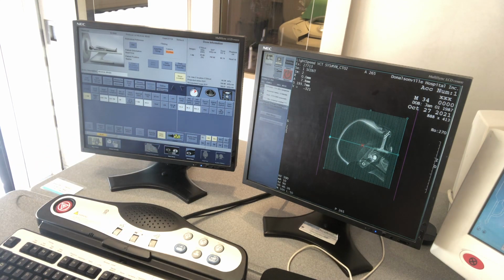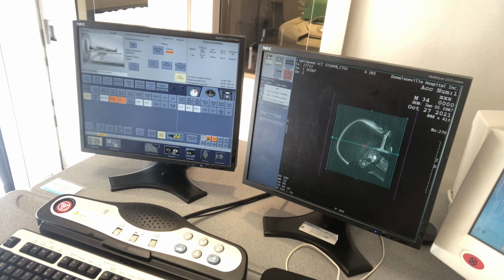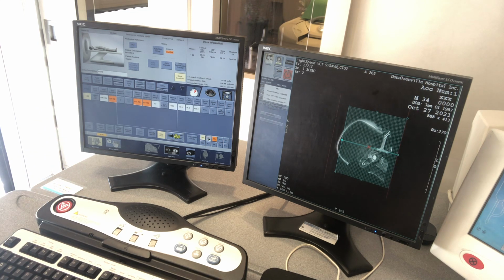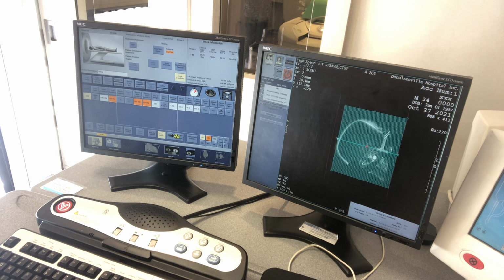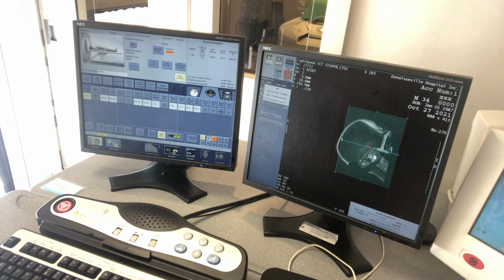So then you would come back over here and say this was cut off like that and we needed to adjust it to get more. So you just open your box up and we need to check R2 and 3 again? Yes. So you'll just check your R2s and R3s again. See how the box is cut there? So open it back up. And R2 was cut again, so let's open that back up.